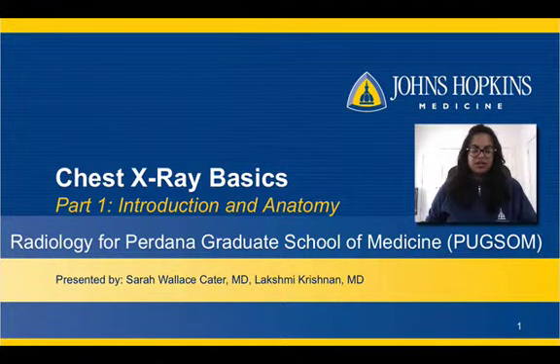I'm Lakshmi Krishnan. In this section, we will discuss an introduction to the X-ray, including physics, basic principles, and indications. We will then go over basic anatomy.